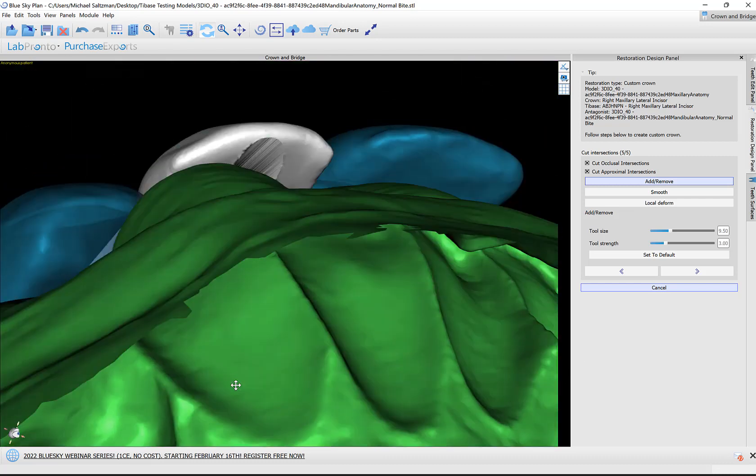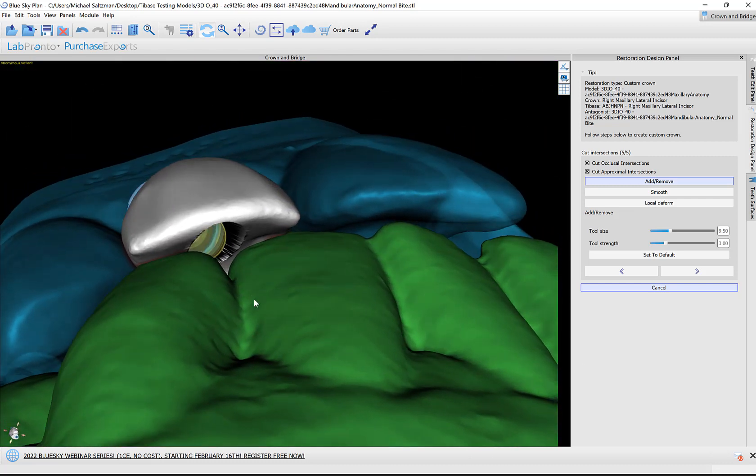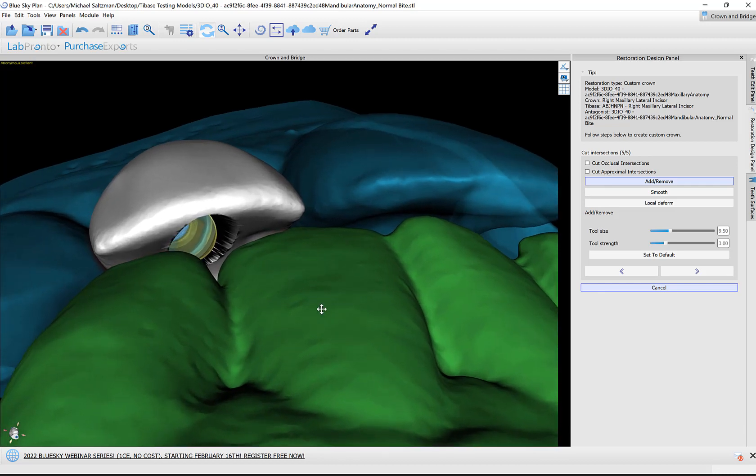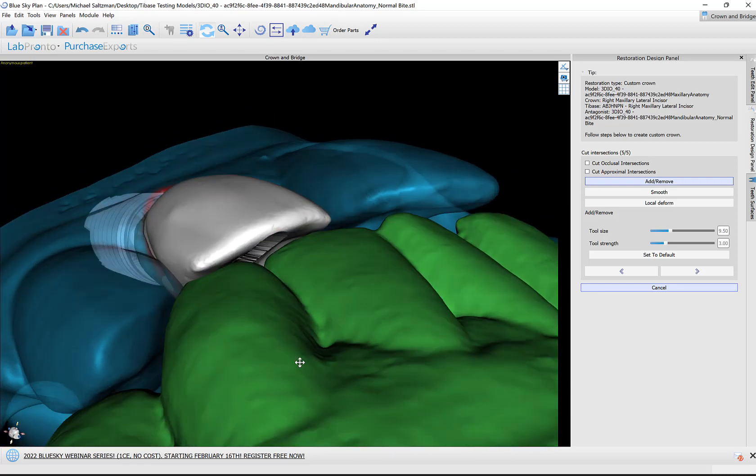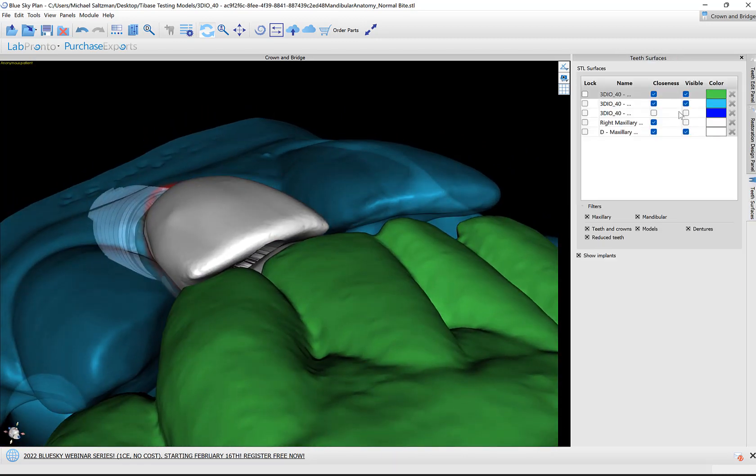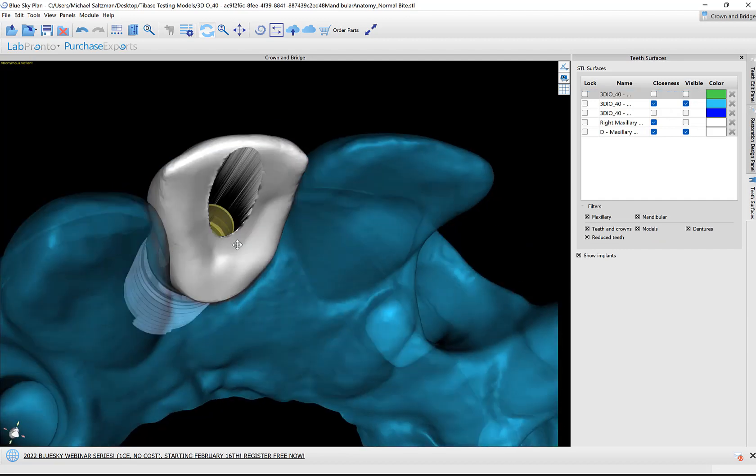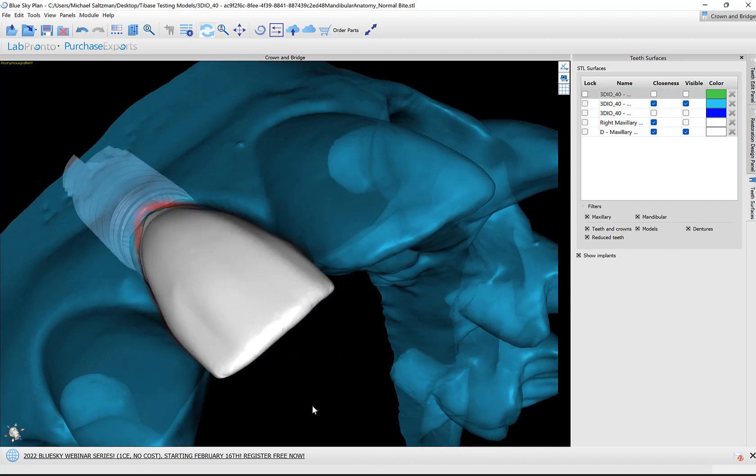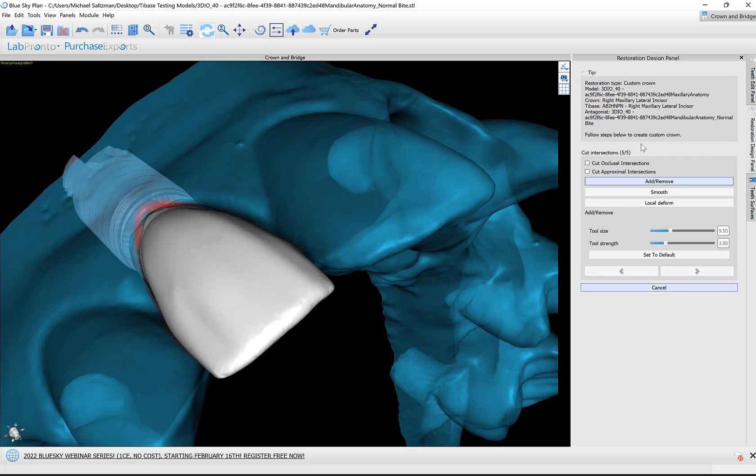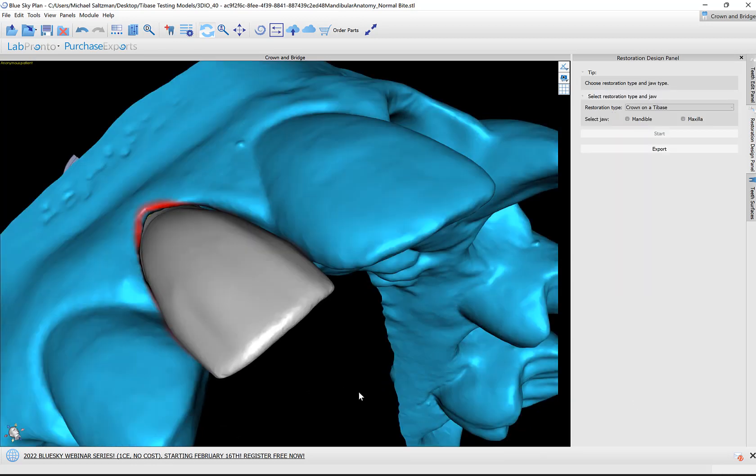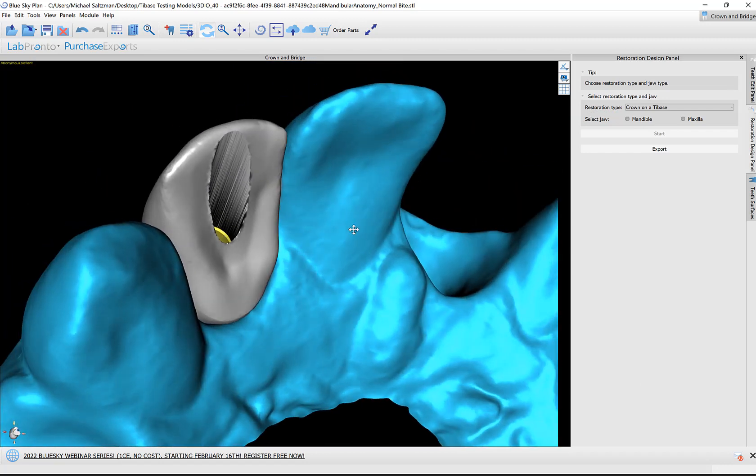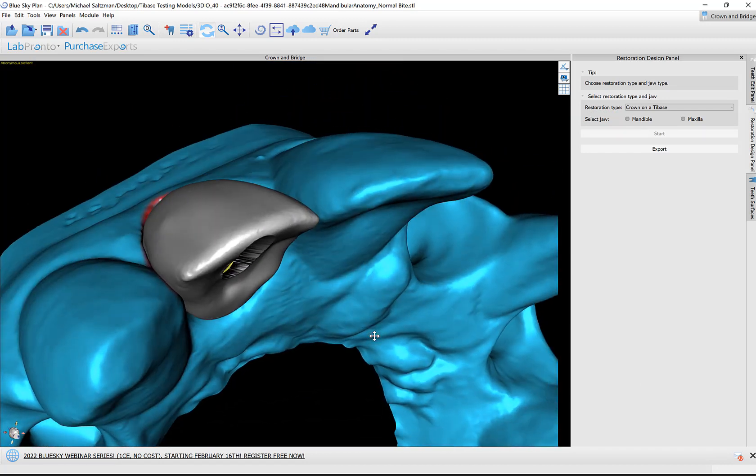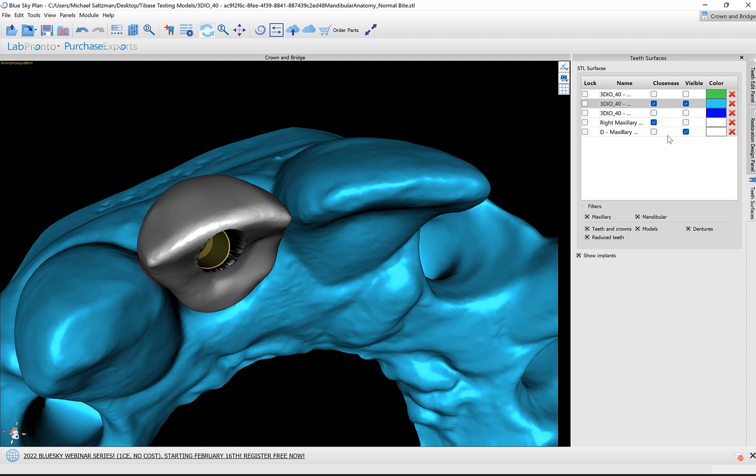Once that is done, if you would like the software to cut the intersections, then leave the checkboxes checked. If you're fine with the design position, size, and intersections, then you can uncheck those checkboxes. Let's turn off the opposing. Once we are happy, we're going to click Next. This is our final stage, 5 of 5. The software has created our crown. Let's take a look before we export it.